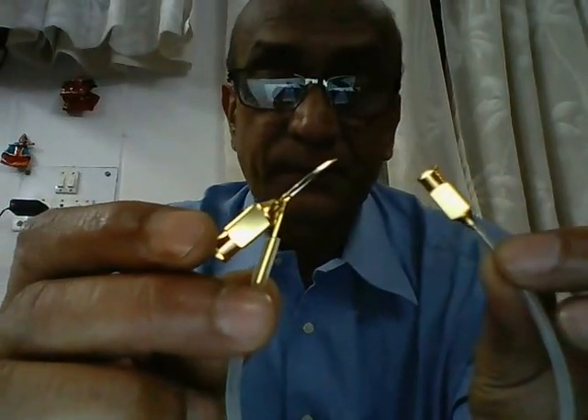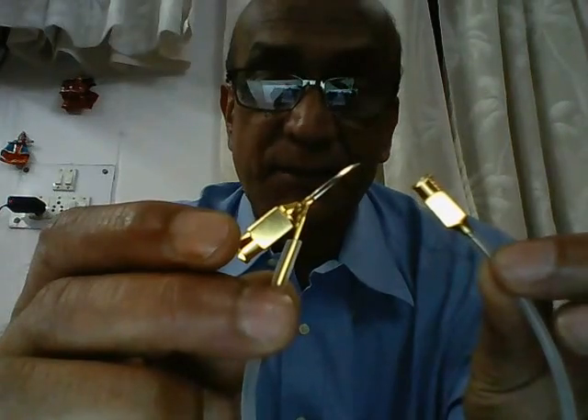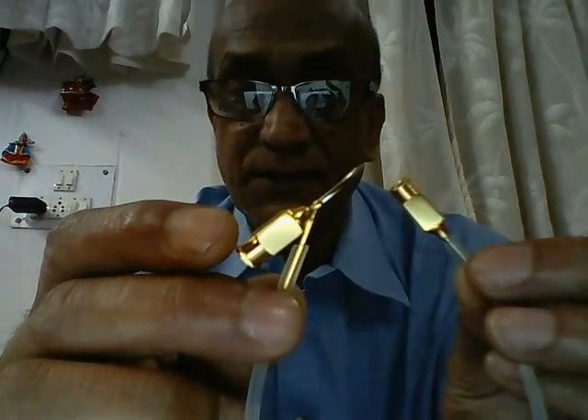The instrument you see in my hand here is known as a Simcoe two-way irrigation aspiration cannula. This is actually a double cannula which has been merged into one. As the term implies, it is used to irrigate the anterior chamber with fluid as well as aspirate the anterior chamber of excess fluid.